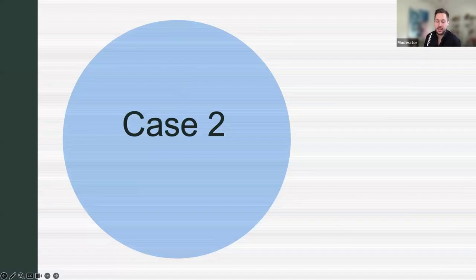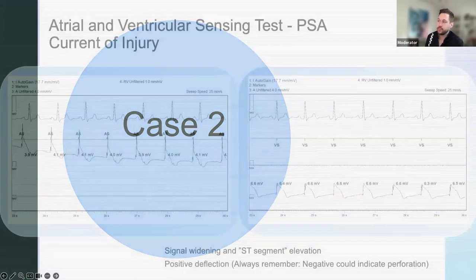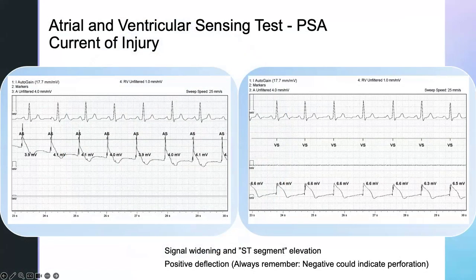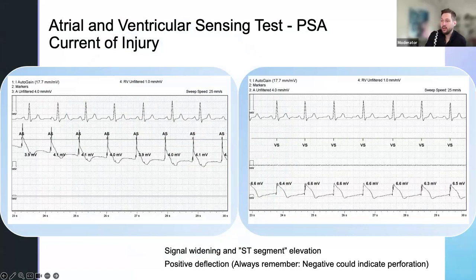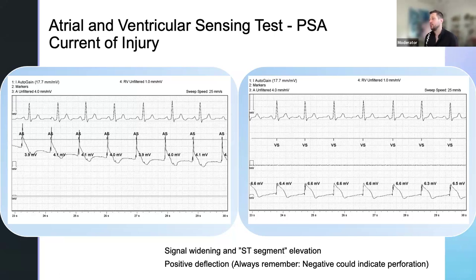Moving along to our second case — we have an atrial and ventricular sensing test on the PSA. We're looking at injury current. We have a good injury current that lines with the atrial event, a beautiful QRS, and we have our ventricular. We have a great injury current — sensing wasn't quite as good as before, but we still have decent sensing for the RV. The sensing is great in the RA. You have good injury current on both. It's positive for both.